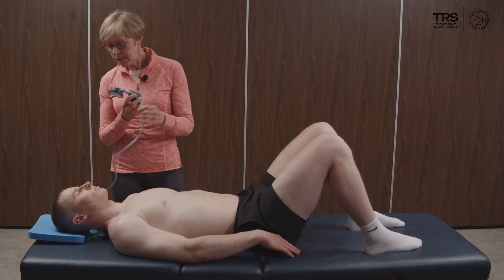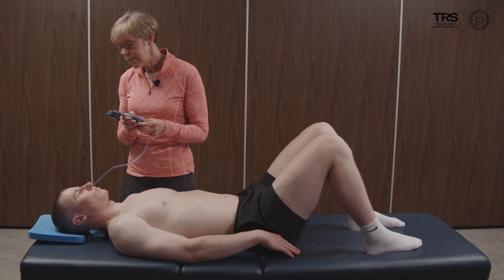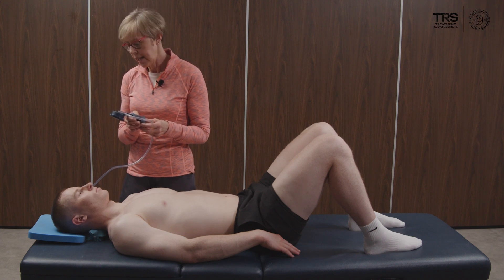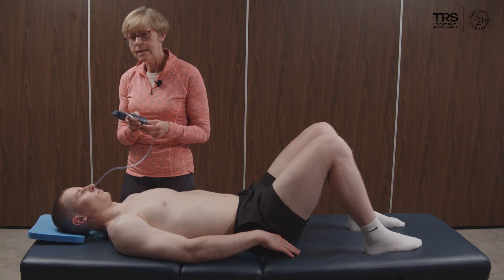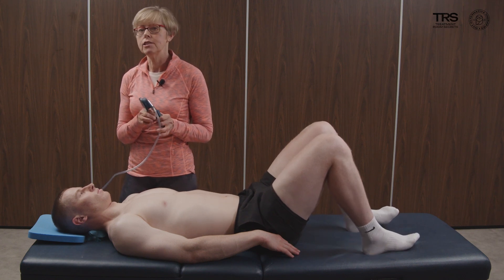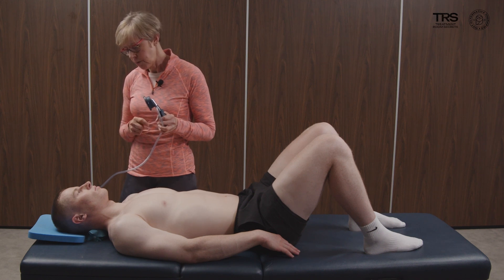We're starting at the bottom of the red, and I'm going to show it to the client. What I want you to do incrementally is to move from the bottom of the red first to the top of the red — that's two millimeters of mercury in excursion — then move on to the next increment, another two millimeters, and again, and again. All in all we've moved eight millimeters of mercury, which correlates with about 80 percent of the range of movement available. Then just relax, release, and have a rest for a moment.